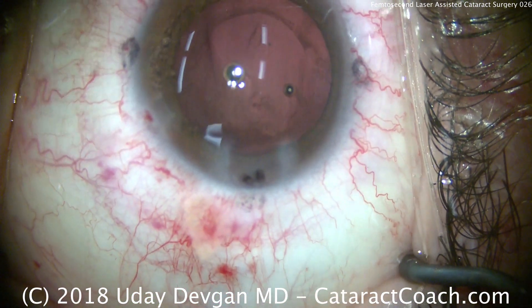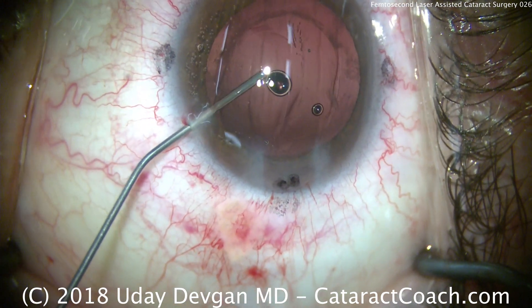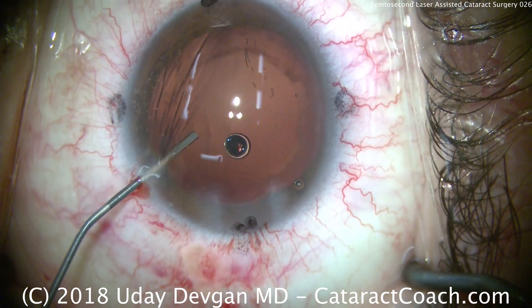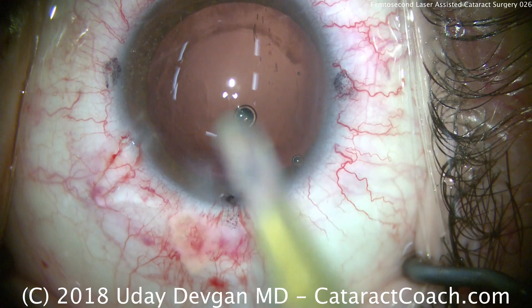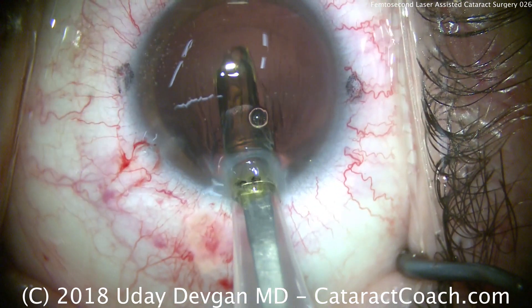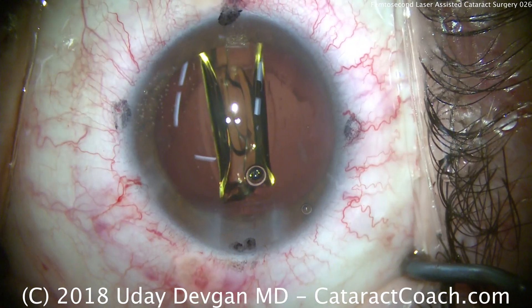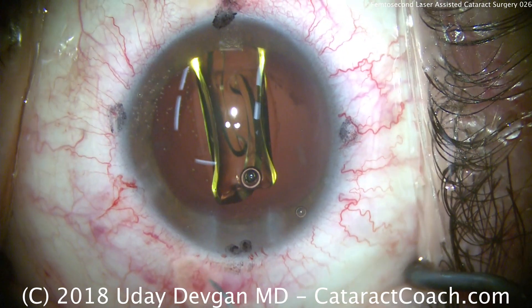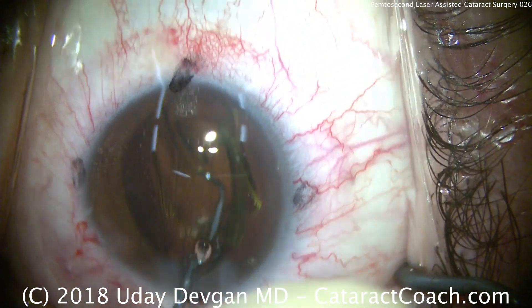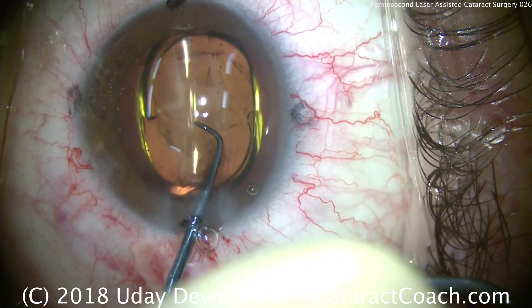We're using viscoelastic to fill the anterior chamber and the capsular bag, and we'll place our lens inside the capsular bag. The edge of the capsulotomy when using the femtosecond laser does look a little thicker and more opaque compared to when it's torn manually. Here comes the single-piece acrylic monofocal lens; we'll place it into good position and let the haptics unfold. We can then see that the capsulotomy is five millimeters — a very appropriate size for this six-millimeter optic.